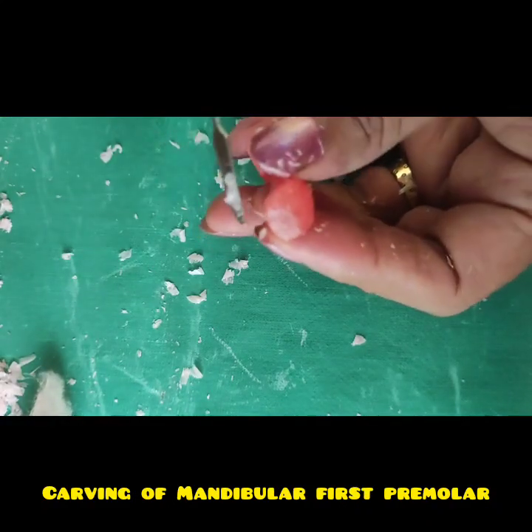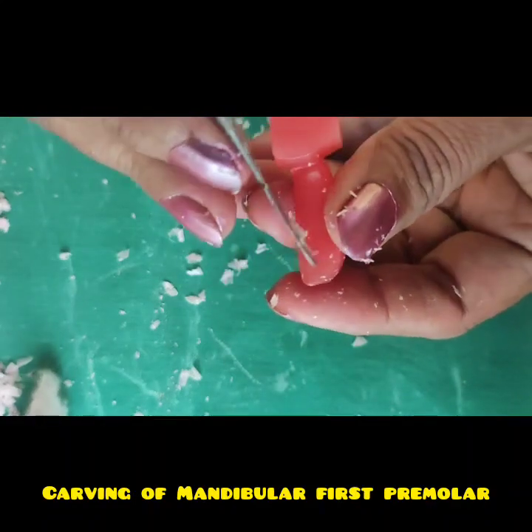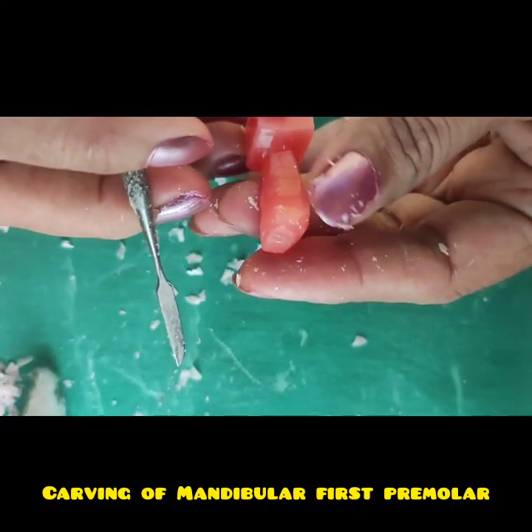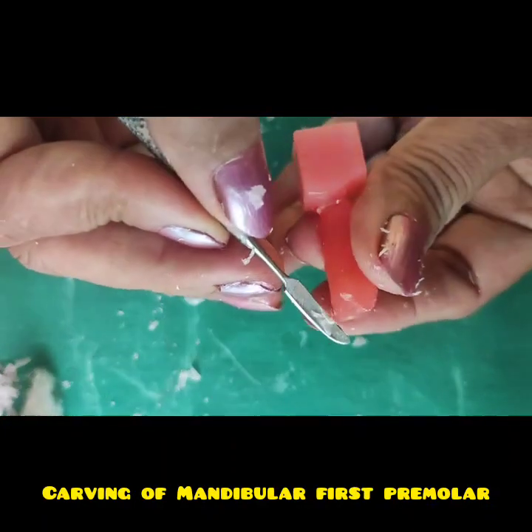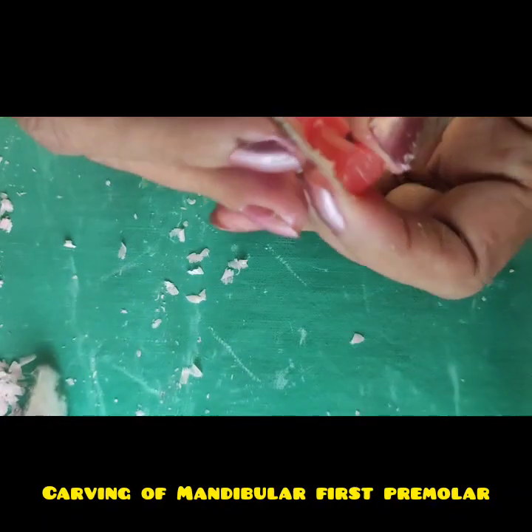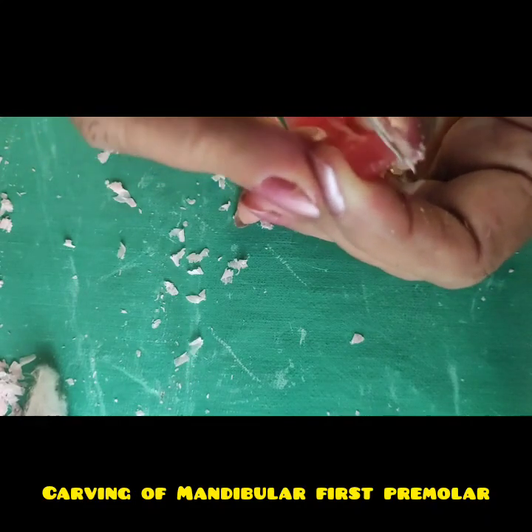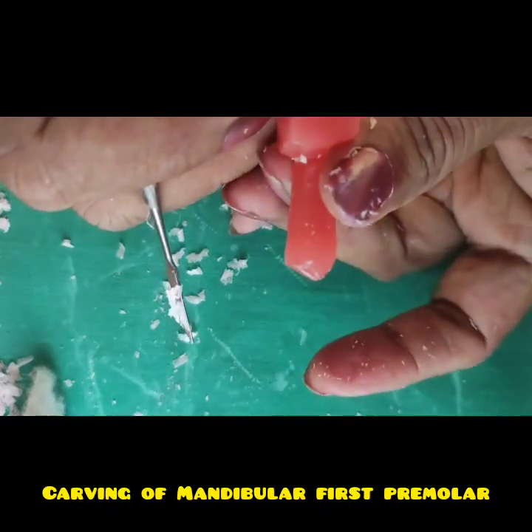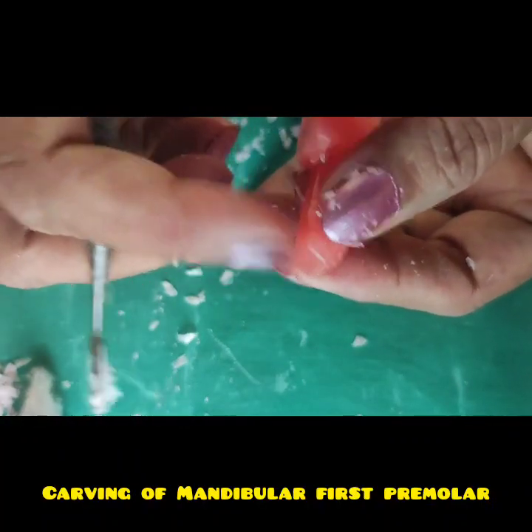Now you can see the occlusal surface is looking straight. So I will reduce the occlusal surface at a 45-degree angle, sloping. I will keep my carver at an angle like this, and move it between thumb and index finger, and reduce till I reach the labial edge like this. You can make out only a little sloping, a 45-degree angle. So this would be my occlusal surface.